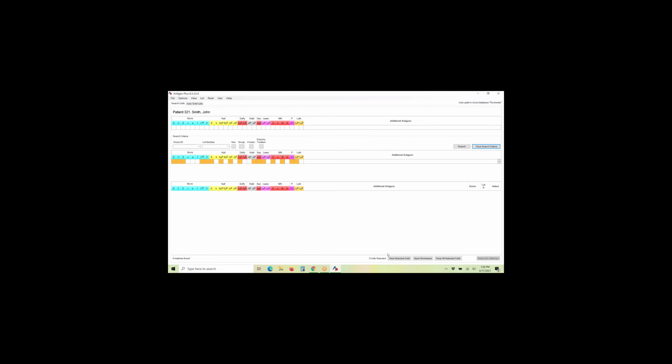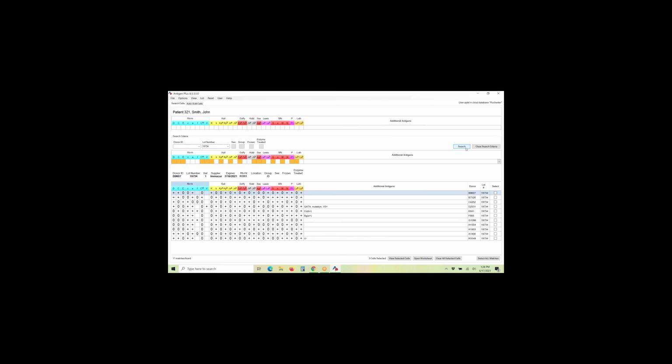And I'm going to take panel 19734. So just go to my lot number, and I'm going to look for 19734, and there it is. And I'm going to click search. And I want to run this entire panel. So I'm just going to click on select all matches. That's going to check mark everybody. And I'm going to open my worksheet.